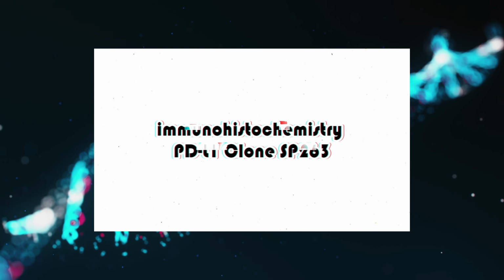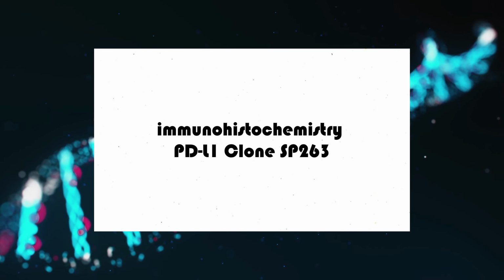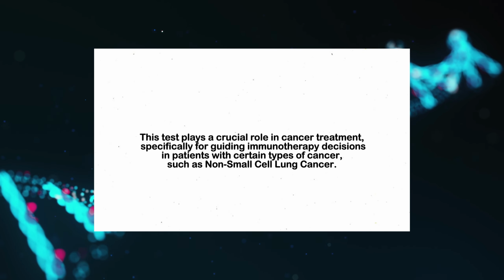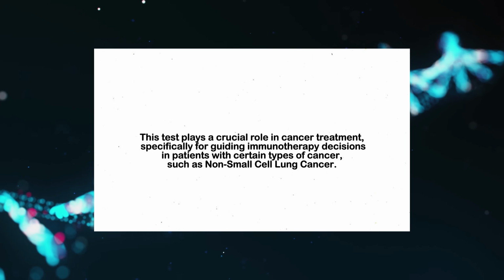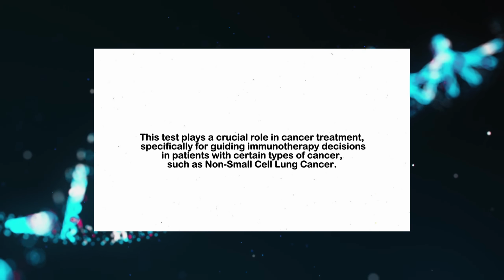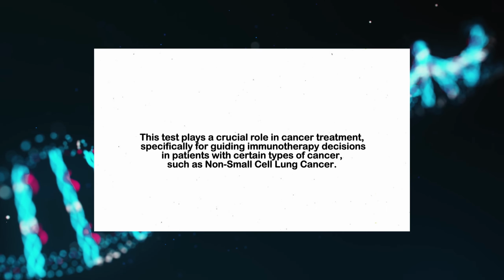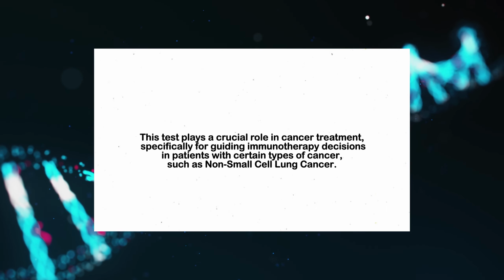We're focusing on the PD-L1 clone SP263 test using the Ventana platform. This test plays a crucial role in cancer treatment, specifically for guiding immunotherapy decisions in patients with certain types of cancer, such as non-small cell lung cancer. Let's break down what you need to know about this test.